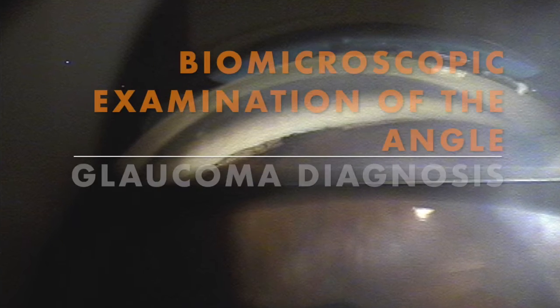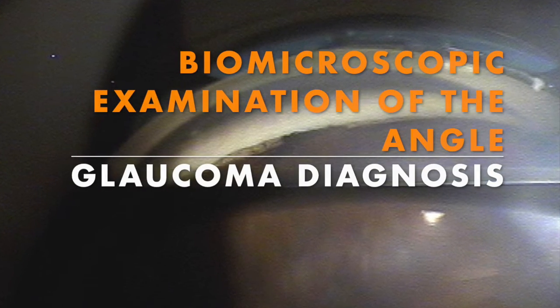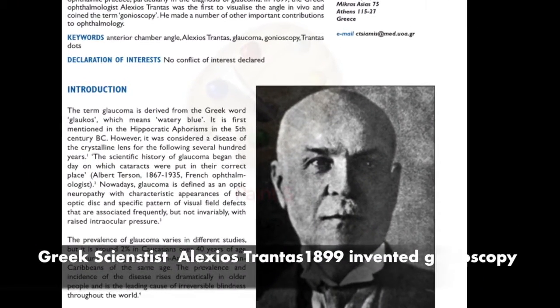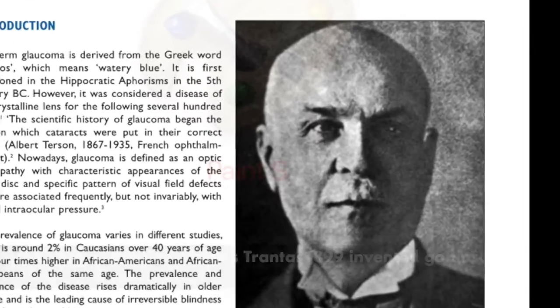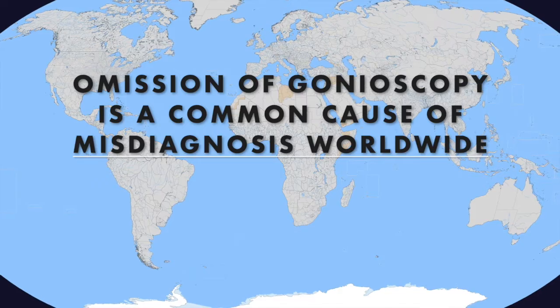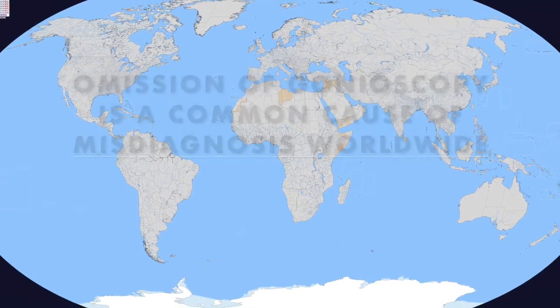ABC of Gonioscopy. Gonioscopy is a biomicroscopic examination of the angle. Greek scientist Alexios Trantas invented gonioscopy in 1899. Omission of gonioscopy is a common cause of misdiagnosis worldwide.